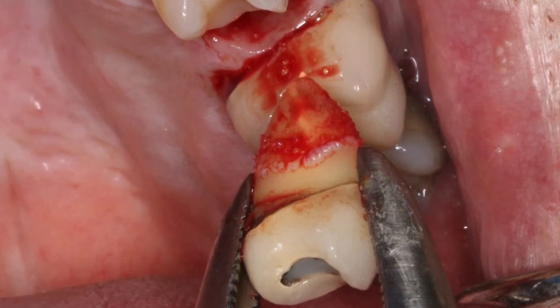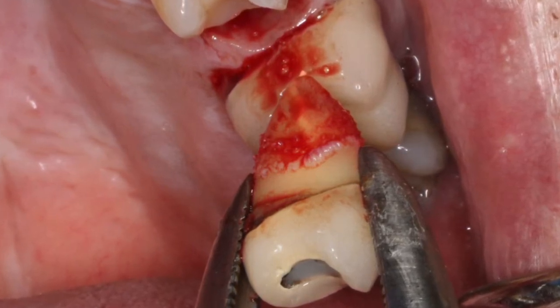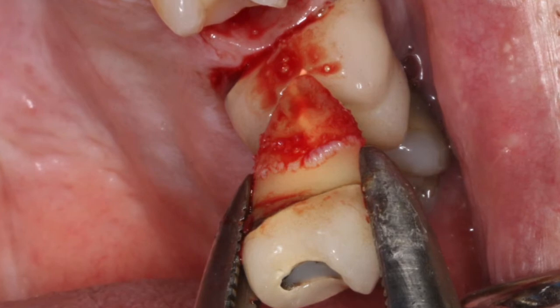The interceptal bone is what holds the interdental papilla in place. So we're simply able to remove a tooth atraumatically.